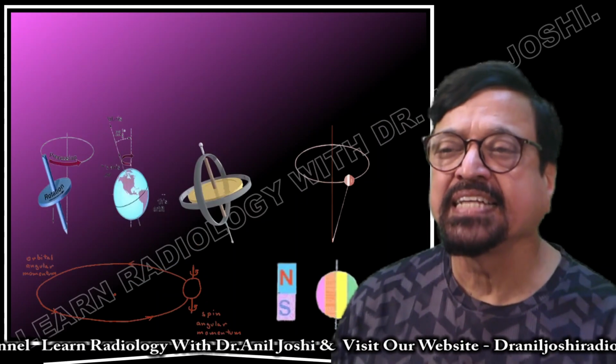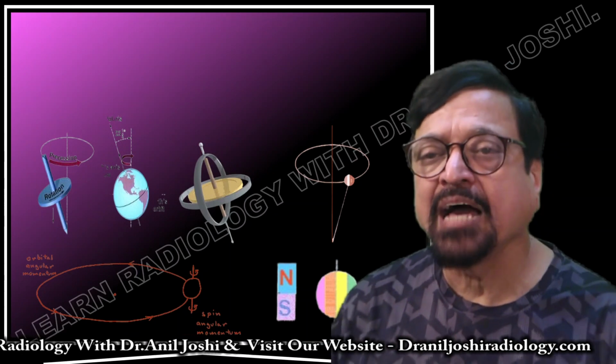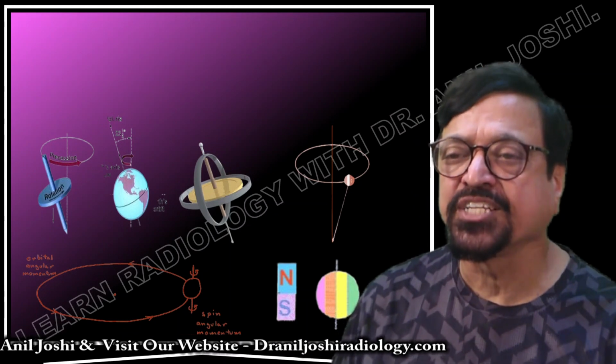Now here again we are seeing the same example in different ways to get an idea about the precession in a proper way. Now you can see the change in axis as well as the rotation.